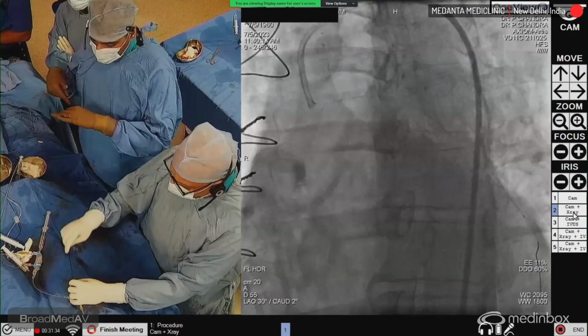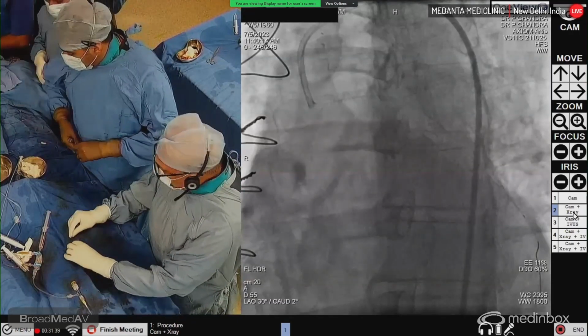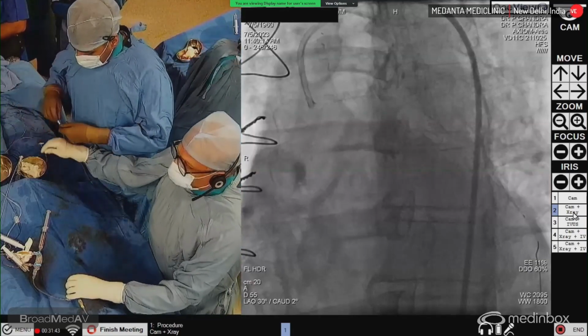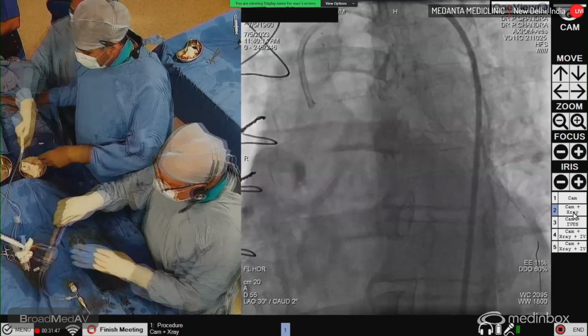Nitro, please. Nitro and maybe some nicorandil. You have nicorandil? Nicorandil. Yeah, the ECG is okay. The hemodynamics are still fine.